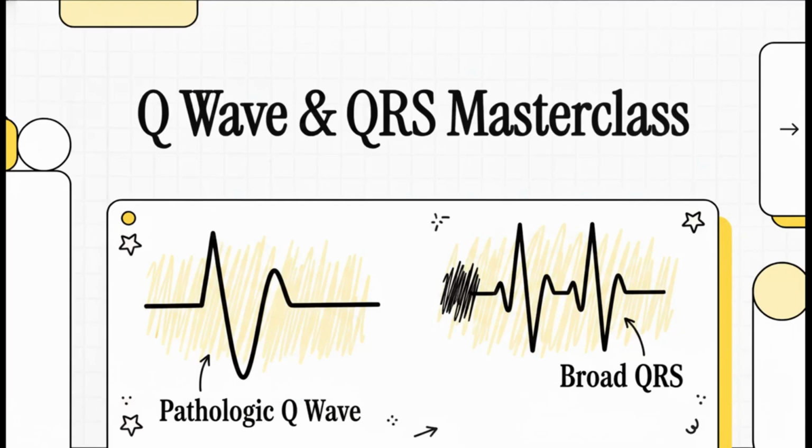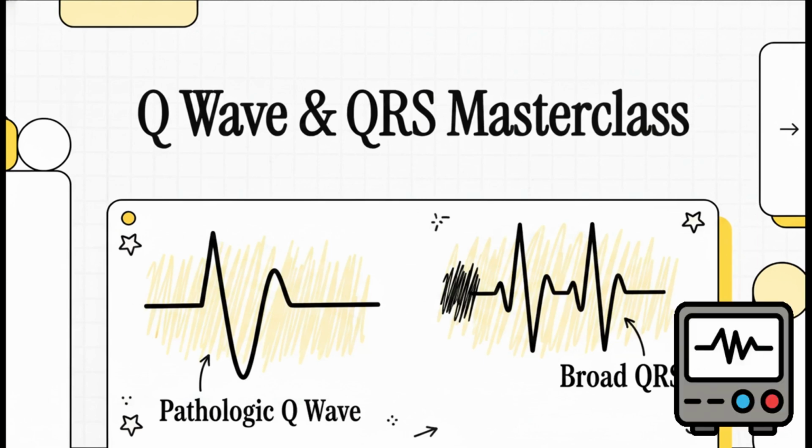Welcome to this explainer. Look, mastering EKGs isn't just some academic exercise you do for exams. It's a critical, life-saving skill. Out in the ER, rapidly recognizing a pathologic Q wave or a broad QRS literally dictates your immediate clinical action. So let's jump right in.